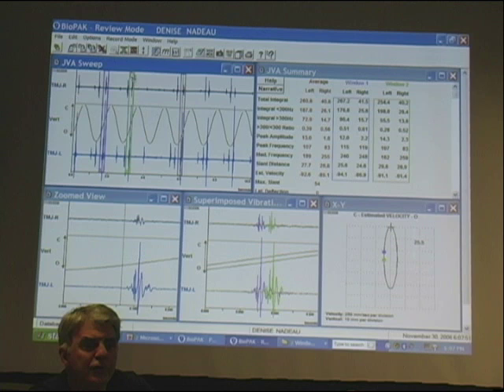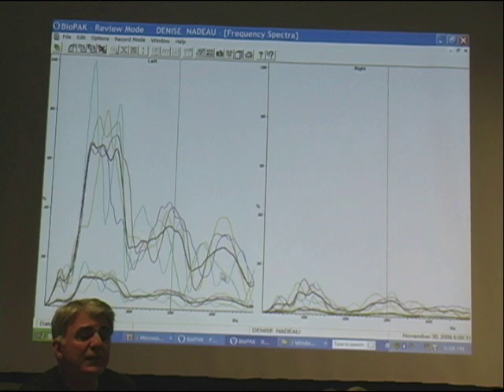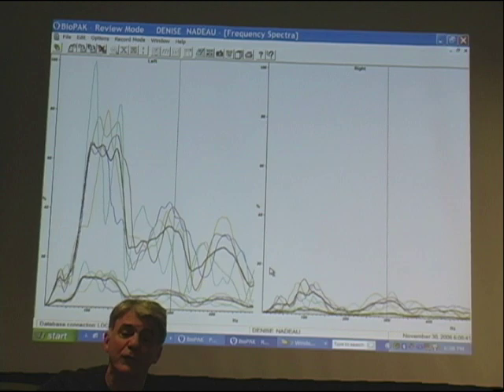And when we see something like this, it's very significant for a chronic disc displacement, a chronic, probably ex-disc displacement, no longer displacing, with very high integral, with significant degenerative disease, worse on the left.